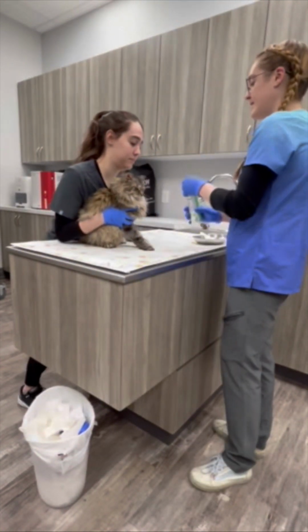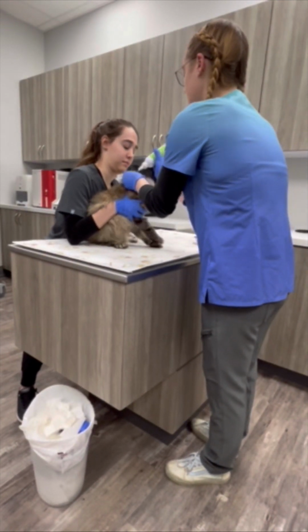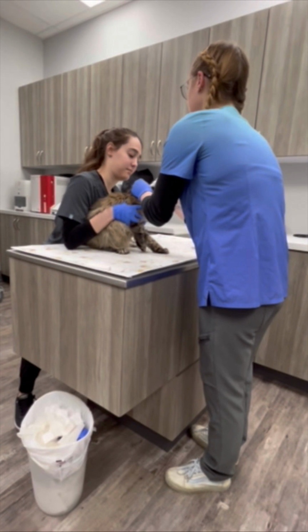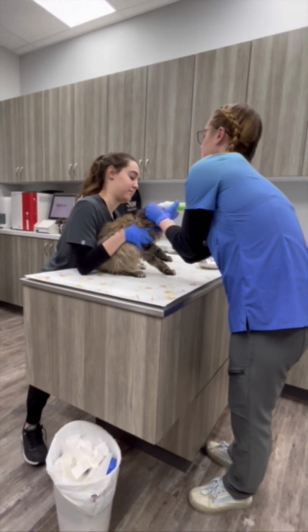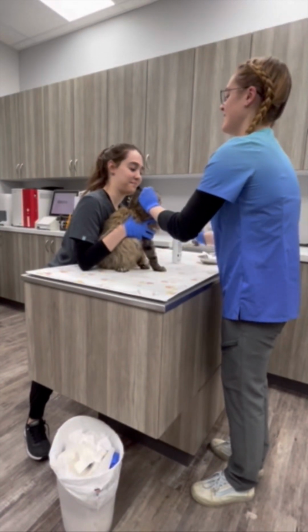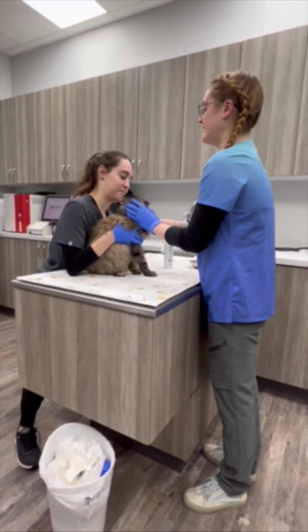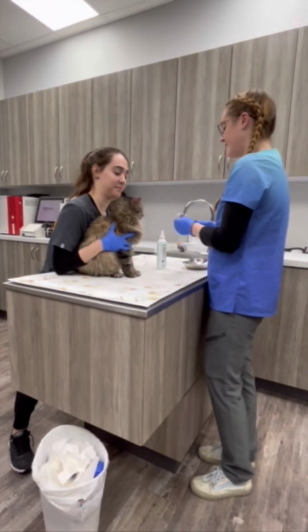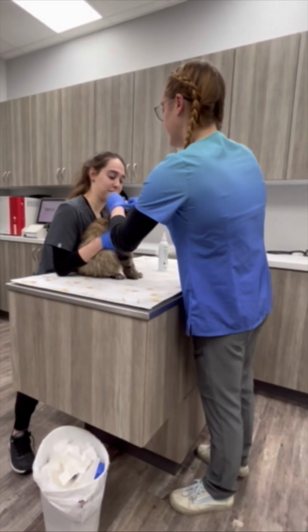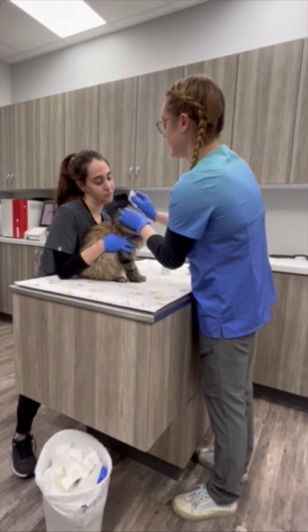And then I'll be repeating this on the right ear. Again, 1 to 3 ml of fluid. Massaging the external ear canal to work the fluid into the ear, letting her shake, and then again taking a sterile gauze to wipe the external ear canal and the pinna clean of any excess solution.